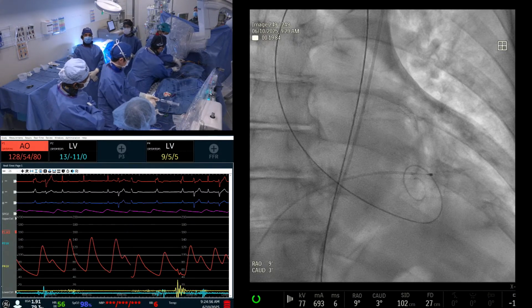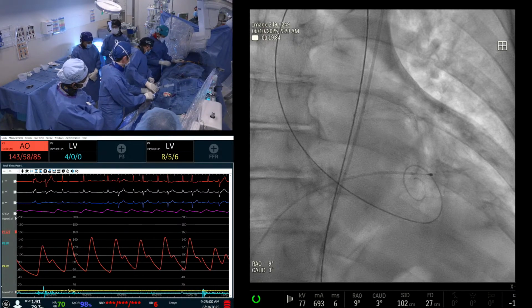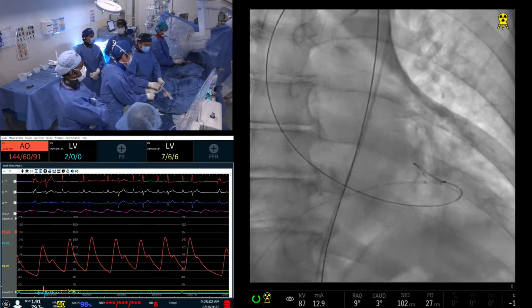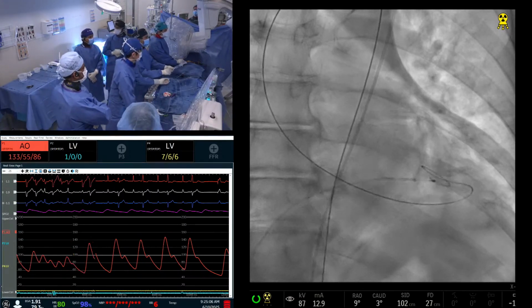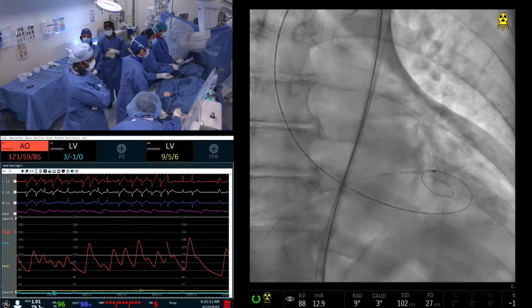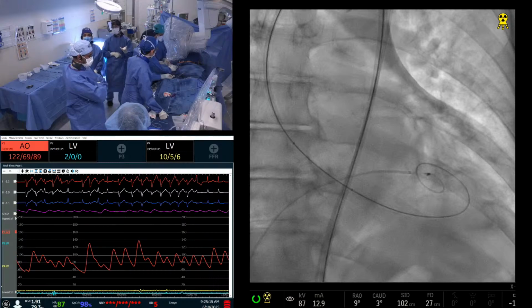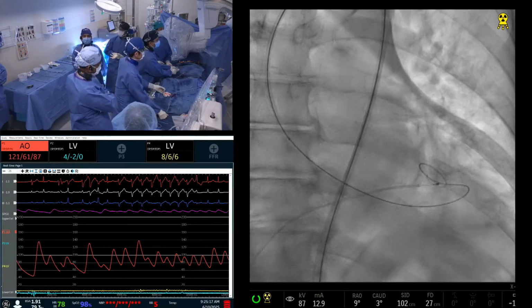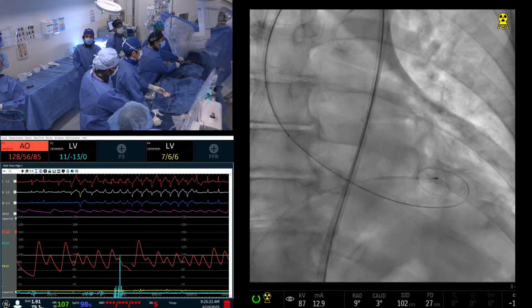So we now routinely post-dilate if we think the patient needs it for durability reasons. Just like in coronary, I'm sure Dr. Sharma will tell you that after your PCI, you will not just leave it alone. You will definitely post-dilate to make sure it's optimally expanded. And now there are imaging studies, OCT and others, to confirm that. We obviously don't have OCT or IVUS for the TAVR valve, but certainly it's important because we see that on CT scan.